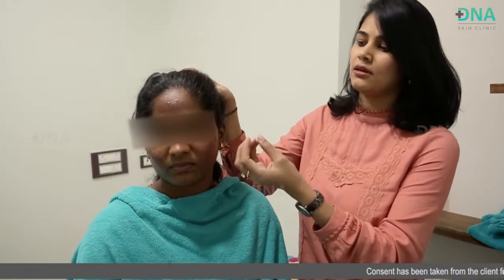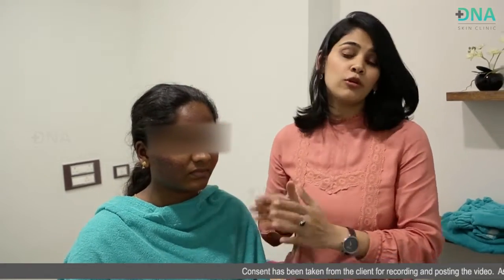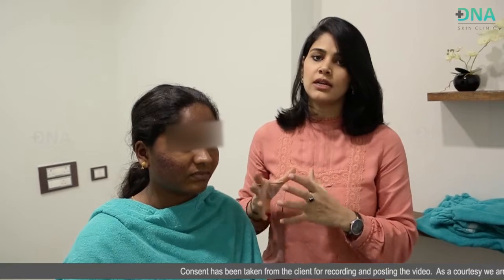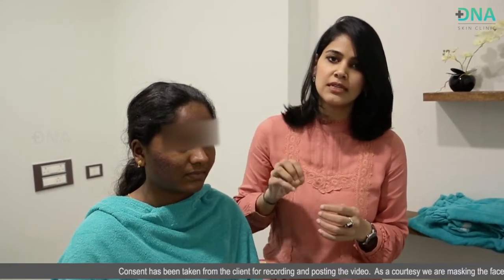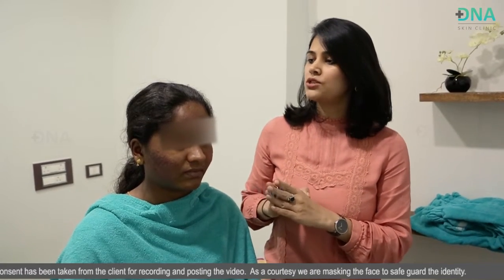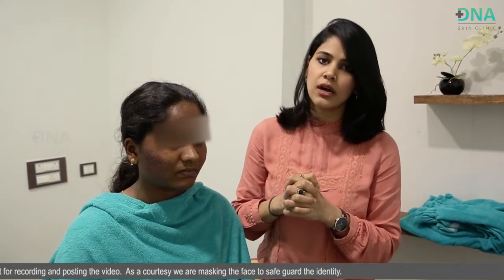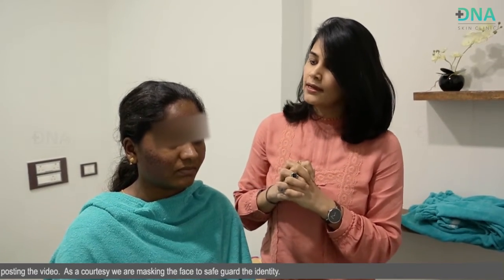Post-procedure, the treated area looks a little bit swollen, a little erythematous. This should all come down in a couple of hours, and the patient or the client will experience a little bit of burning or stinging sensation in the treated area. Again, that will also come down in a couple of hours. Post derma rolling, we advise the patients to wash their face with cold water. Do not use hot water. And we advise them to use the creams that we suggest, so that wound healing happens in a better way and there is no chance of infections occurring.